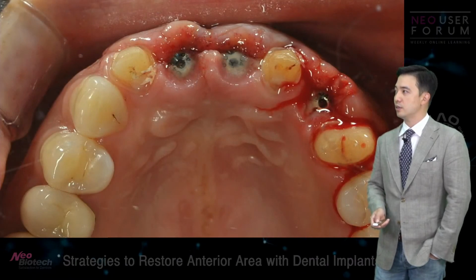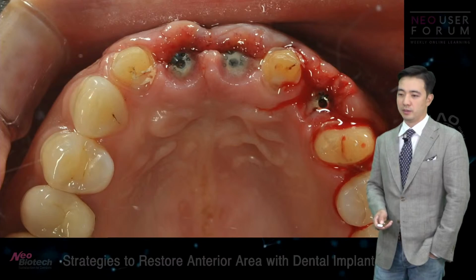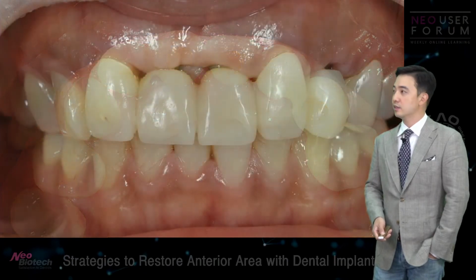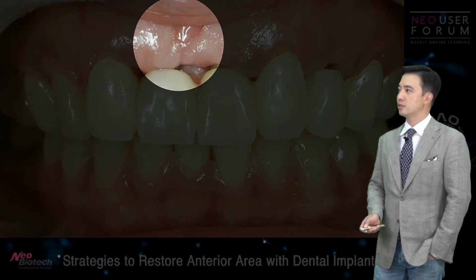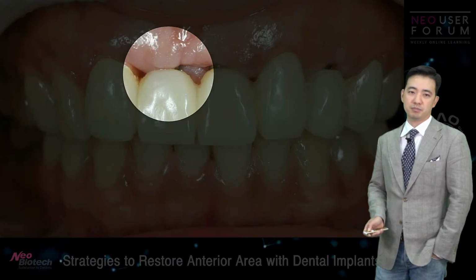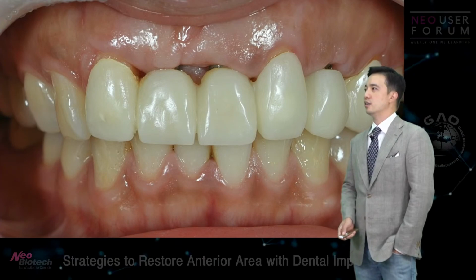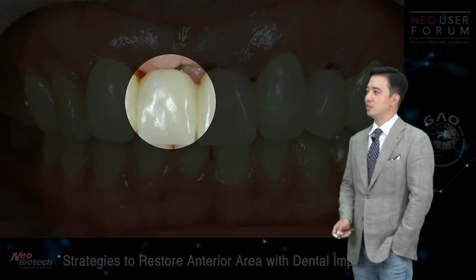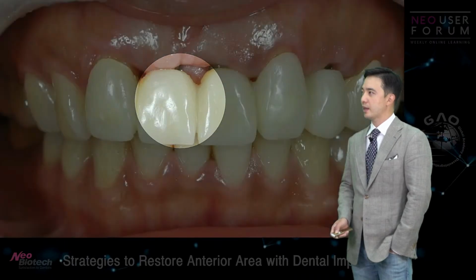Okay, so this is after 2 weeks, I think, on the stitch out appointment. Everything looked nice, except the patient started complaining, oh, doctor, there's some metal showing up beneath the provisional restoration. And I said, oh, okay, well, that's part of the healing process. And we can make these two longer, and then it's going to cover the healing abutment, etc.